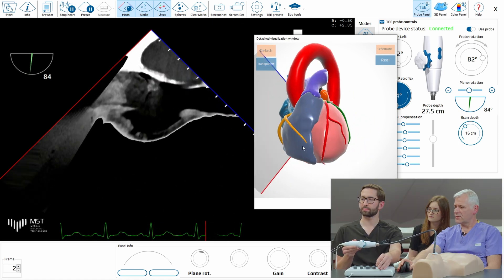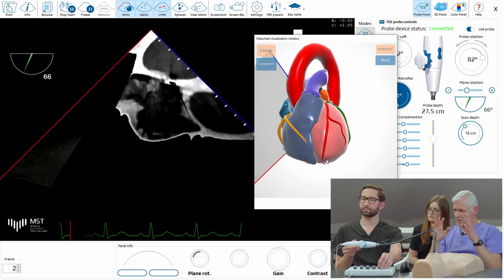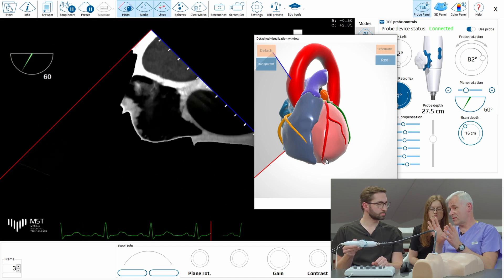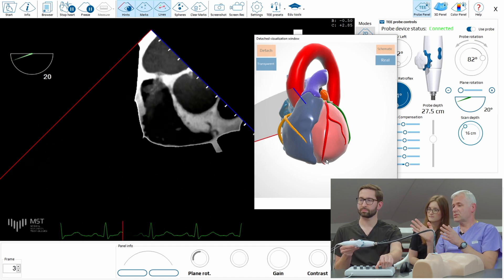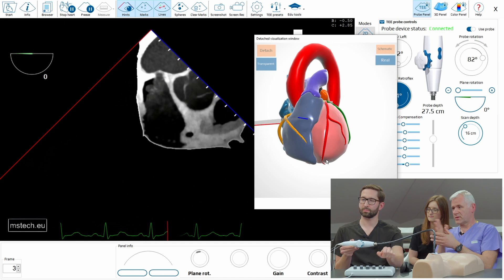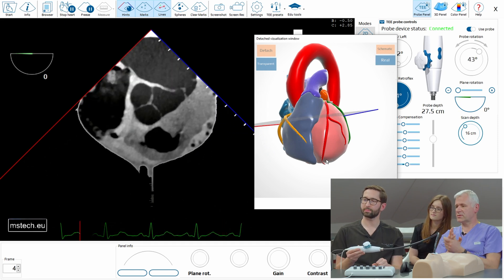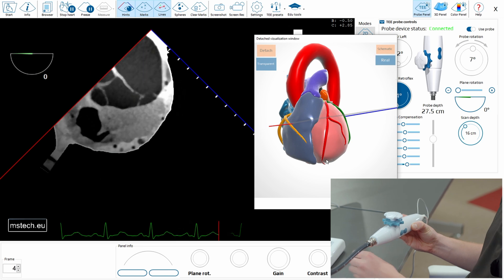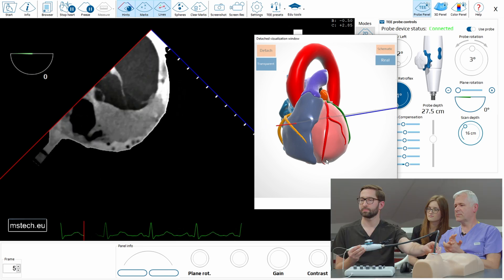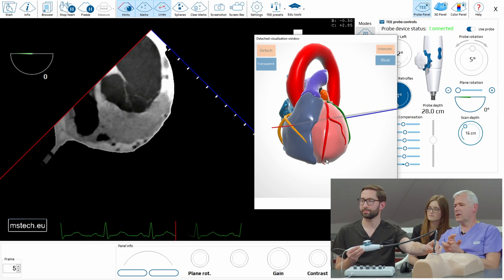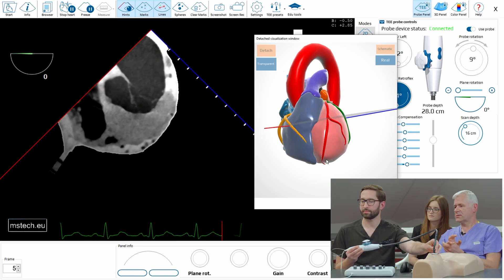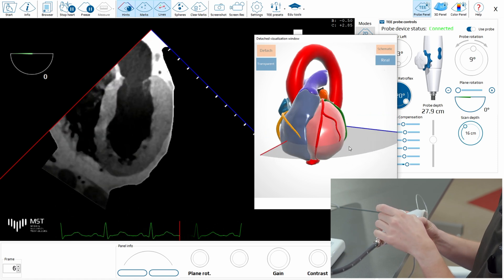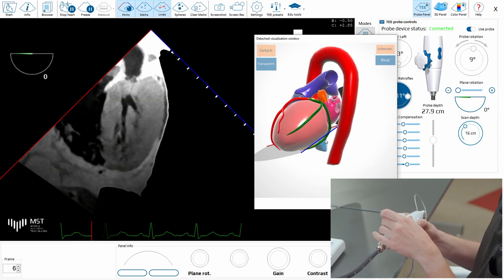Now we leave it and go to the mitral valve. I advised you to go to zero. Very good. Go mitral valve in the center — slightly deeper. And retroflex. Try to do it yourself. Retroflex.